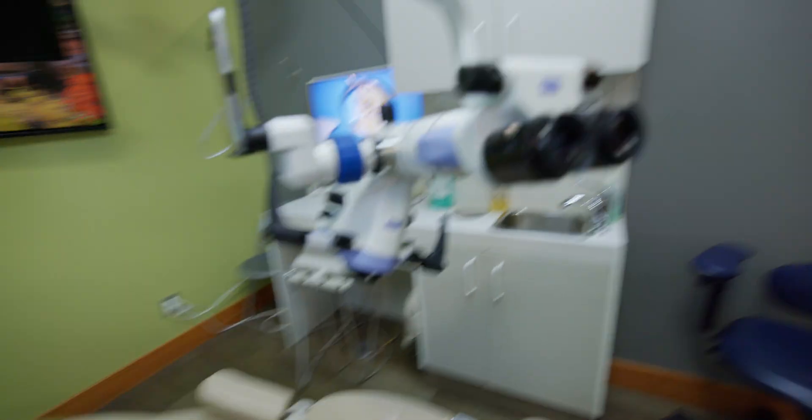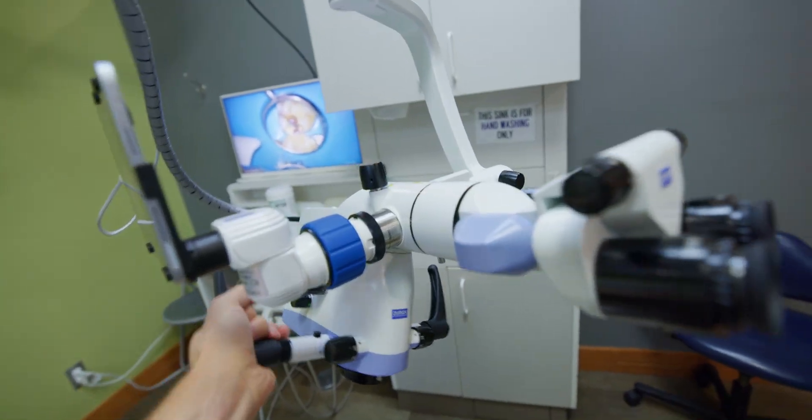Now I actually like it more than working with the 2380. This also happens to be their entry level microscope — at least globally; they may have a less expensive scope within China, but for us around the world, the OMS 2050 is their entry level scope. To have this level of functionality at that tier is pretty incredible.